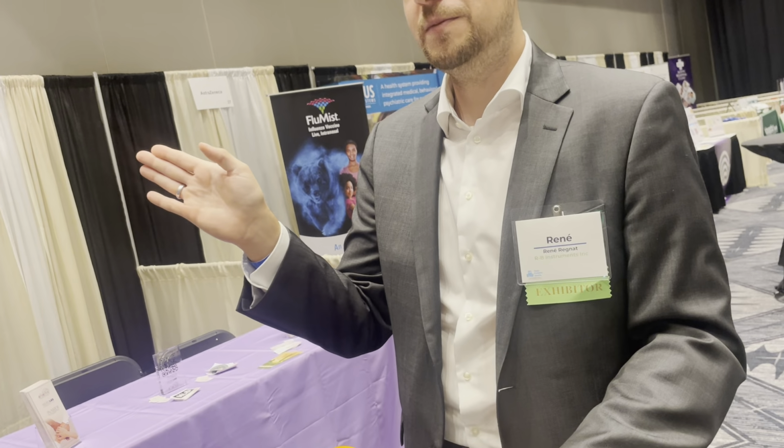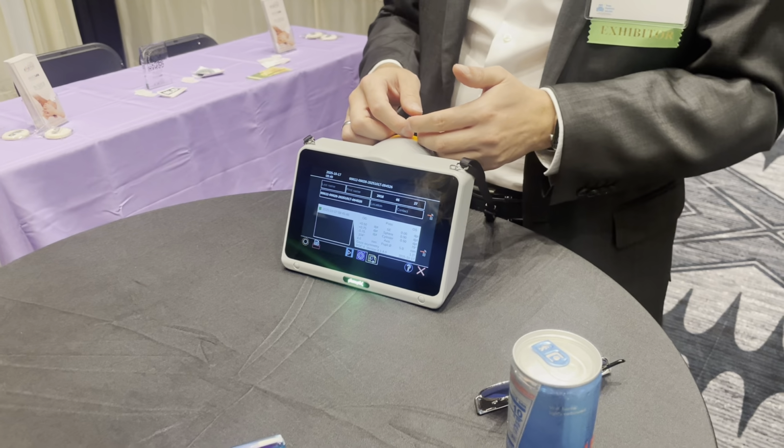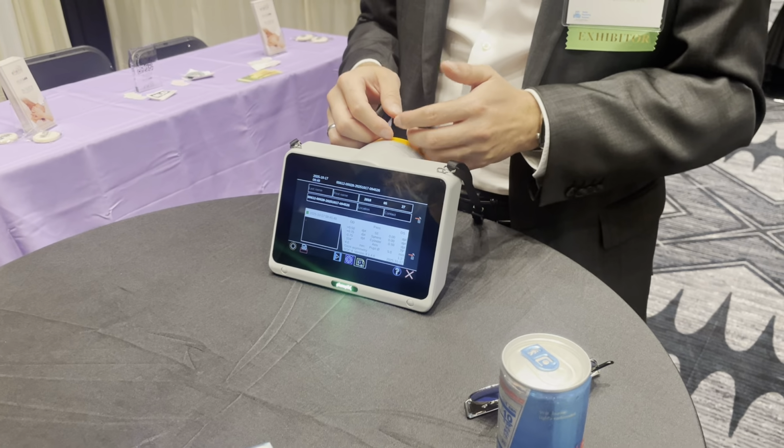Third window, this is the database. We could simply accept that this is an anonymous reading, hit the print button, it will save a PDF. From there, we can plug in a USB drive, download it. If we connect the device to Wi-Fi, we can use the free software PlusOptics Connect for automated printing, automated PDF sending to a folder, anything you want. We could integrate it into an EHR system. This is also doable. But we can also make it a personalized data entry by just typing in the name, the actual birth date, and whatever information I have that I want in there.